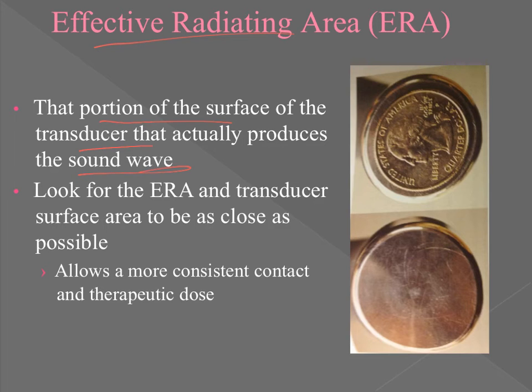So you're going to have to look for the ERA on the actual device itself. The device itself will tell you how much of the actual ultrasonic head is actually transmitting ultrasonic energy. And you can see that most often that effective radiating area is much smaller than the actual ultrasound head itself. Does that make sense, you guys?